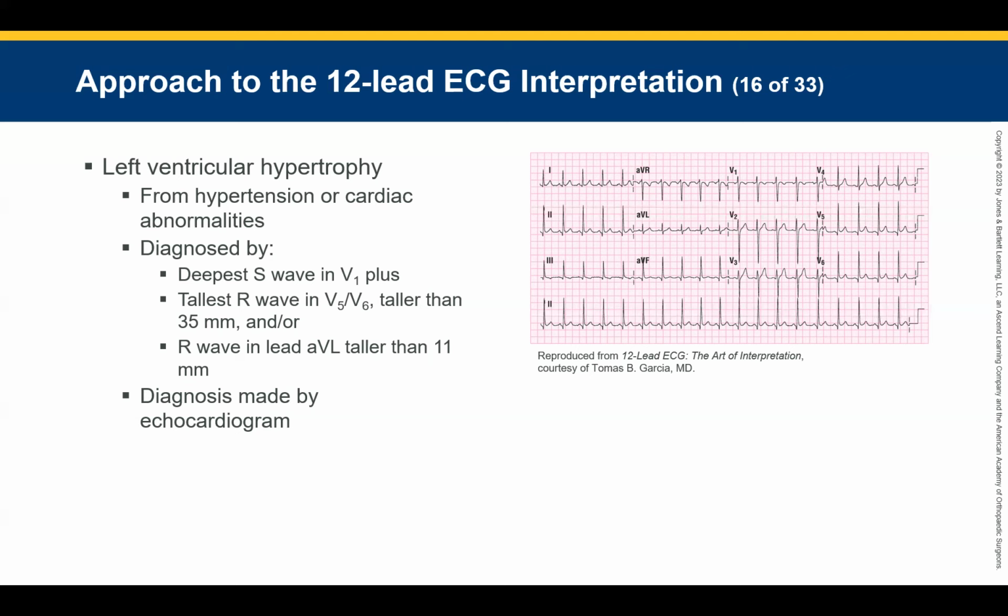I'm going to draw a little squiggly line here because these 2 are complicated. You can get bleed over from the anterior and septal wall. But these 2 boxes, no matter what, this one requires 2 boxes of elevation, and this one requires 2 boxes because V2 and V3 have some normal elevation. Everything else only requires 1 box, but if you touch V2 or V3 in the STEMI, you need at least 2 boxes.